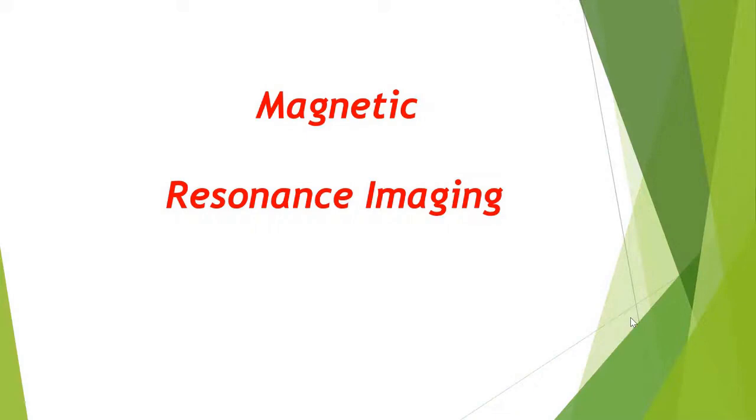Not all tissues respond the same way. If I apply an excitation radio frequency pulse or a magnetic field, or if I magnetize them, they do not receive the signal or lose the magnetization at the same speed or in the same manner. This creates a difference between the tissues in their magnetic properties.